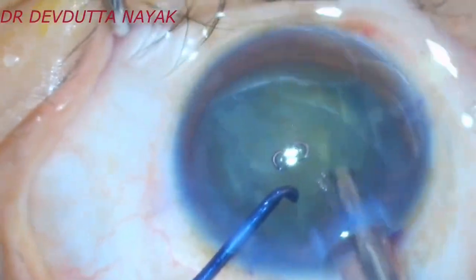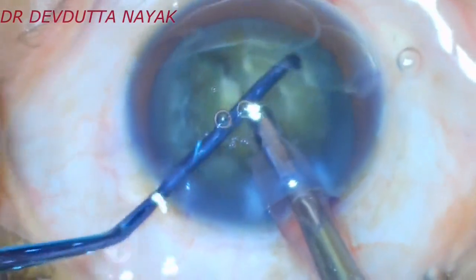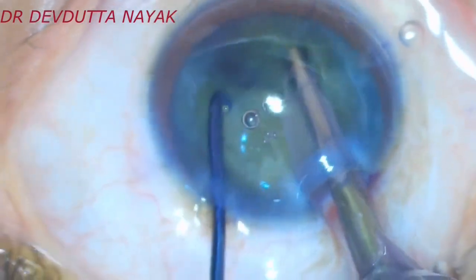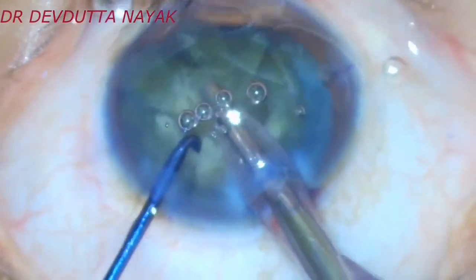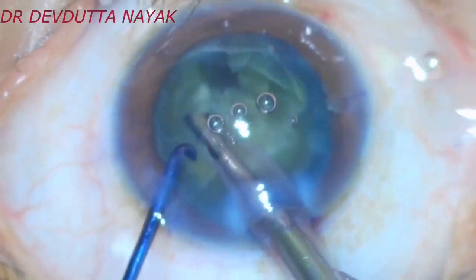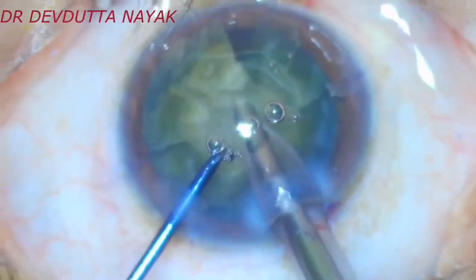The phaco is a fairly regular process. Here we are doing vertical chop to fragment the nucleus into multiple pieces. And after the chopping is complete, we proceed to quadrant removal mode and remove the loose pieces of the nucleus. There is a little bit of posterior plate present there. So in these kind of cases, it is always better to remove the endonucleus first, because after the endonucleus has been removed, the pieces become fairly easy to emulsify and remove.